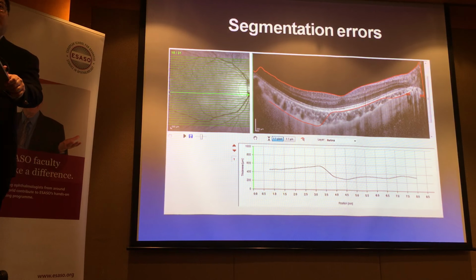You can, because the gas obviously contributes a refractive component. You can try to adjust the focus manually. It's like having an extra lens there, so you might need to manually adjust. I think we've managed to do that, painstakingly moving in and out until you see the retina come into focus within that area, and then you capture it.